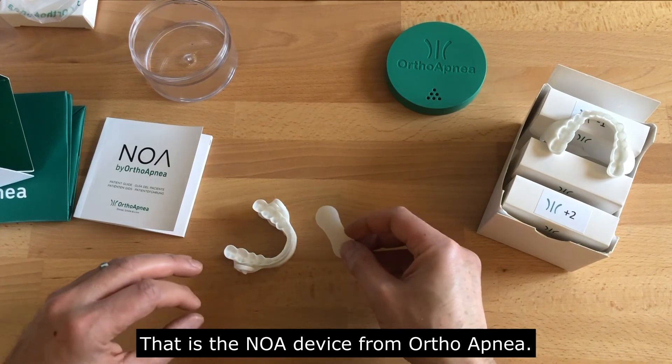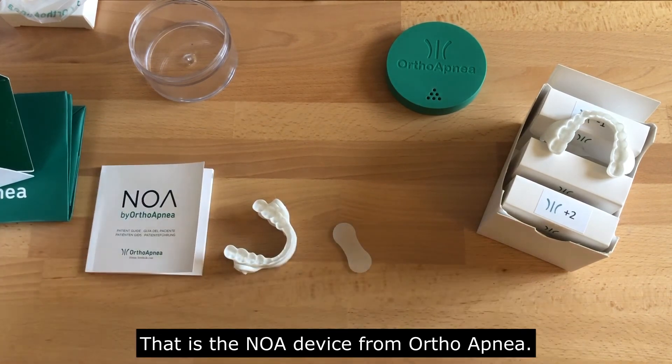So yeah, there it is — that is the NOA device from OrthoApnea.